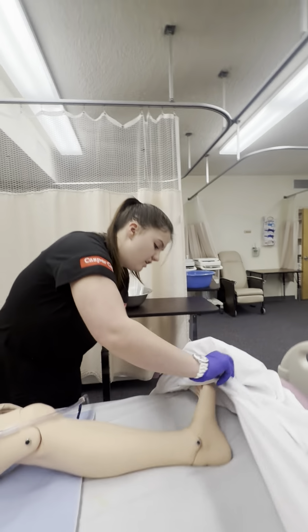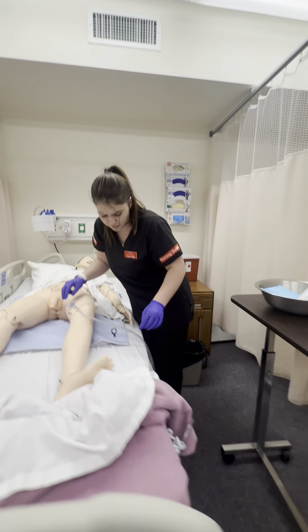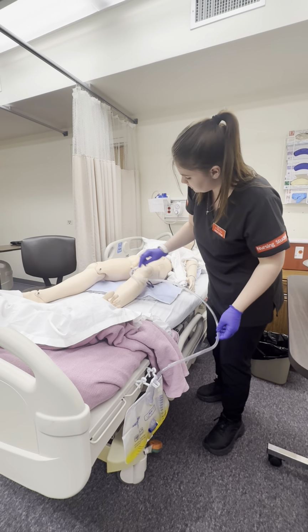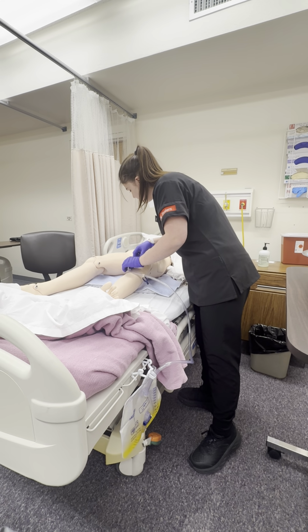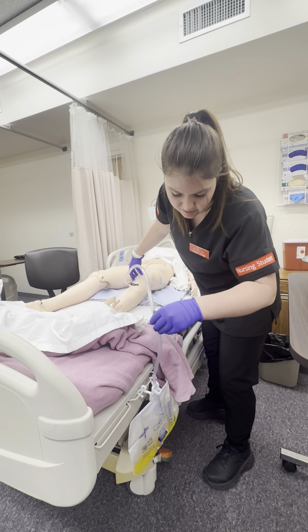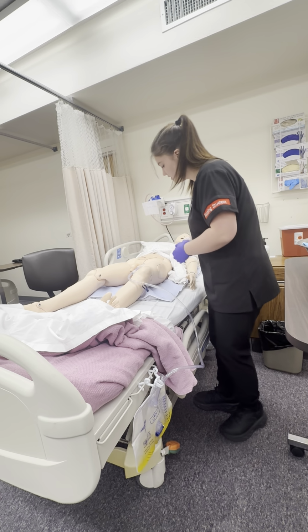Okay, I just wanna see all that tubing. Any leftover urine in here, we just wanna make sure that we drain it into the urine bag. And we wanna do this as gently as possible as to not disrupt the catheter. That balloon is still inflated there. Okay, and it looks like I don't see anything left in this tubing here.